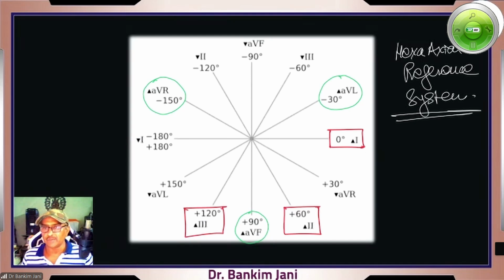In chest leads, we are not able to see the left atrium. In chest system means, which chest system? In leads, you're right. You are 100% right. Because the left atrium is posteriorly situated, that's why there are some special cases when the lead is dropped from the mouth, and it goes midway into the esophagus, and then you start recording it. Right? It makes sense now.